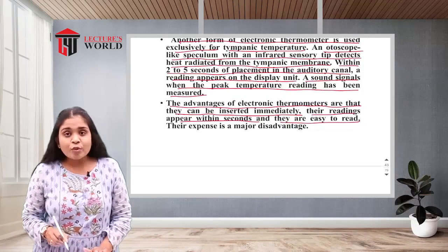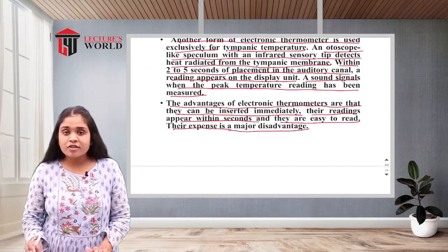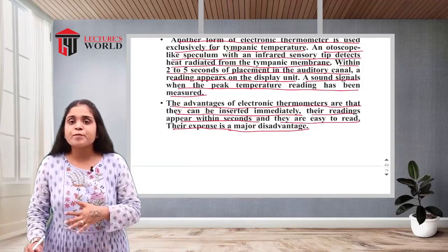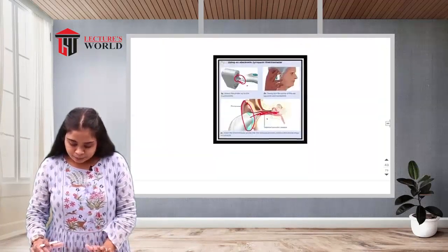So what is the disadvantage of this? Their expense is a major disadvantage. This tympanic thermometer is really expensive, we can say. So that is the most significant disadvantage of the thermometer.